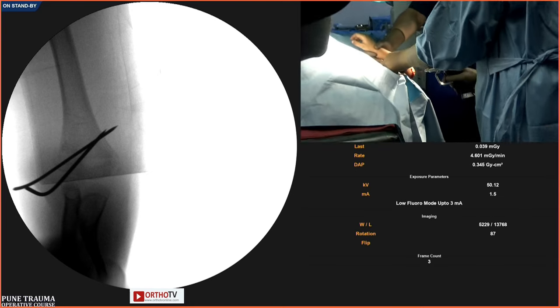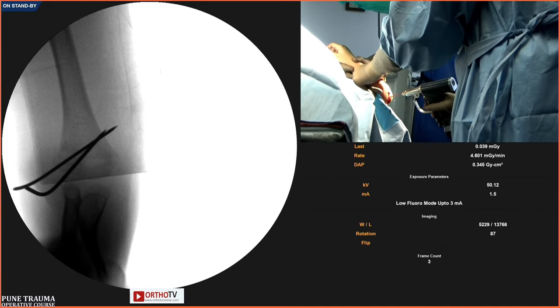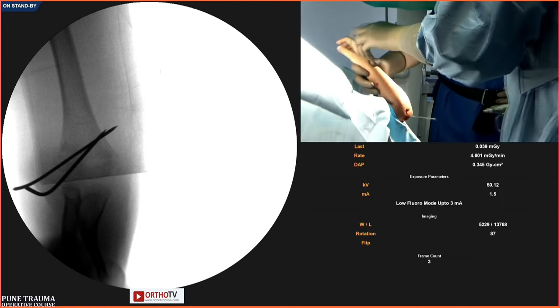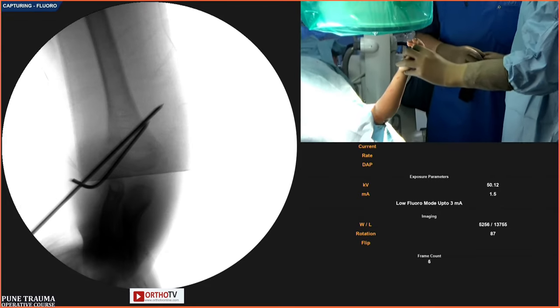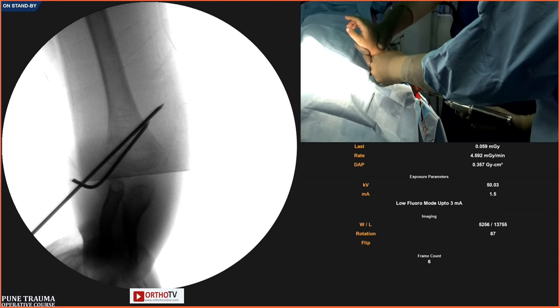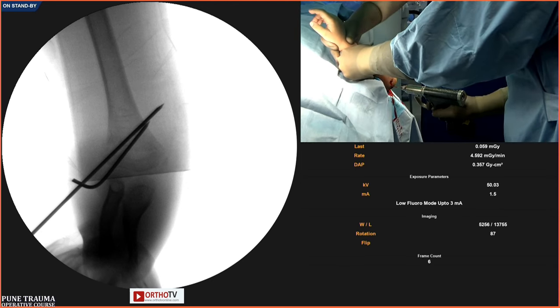I was not happy with that one wire, sir. I'm just revising it. I'm not happy with the second hold. So which was this wire? The column pin? Yeah, the column pin. So just give me a second. Yeah, now I'm okay. Shoot. Yeah, I'm happier now. Hold this. I have a simple protocol.